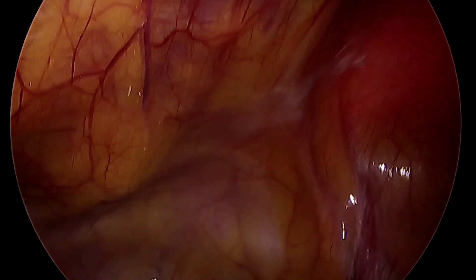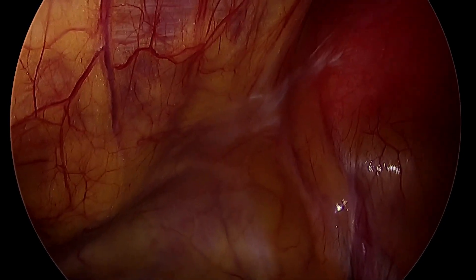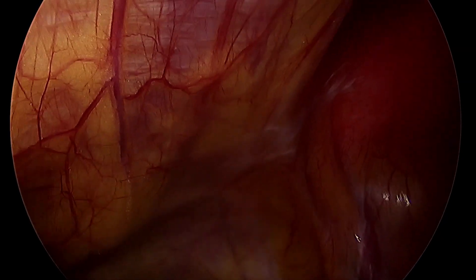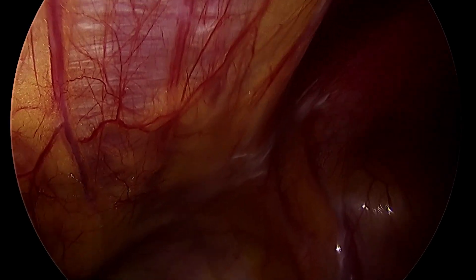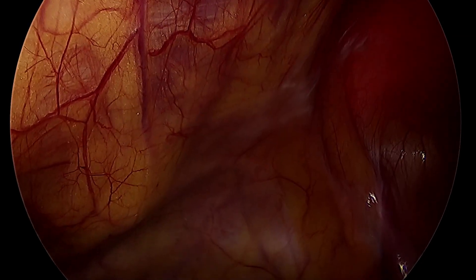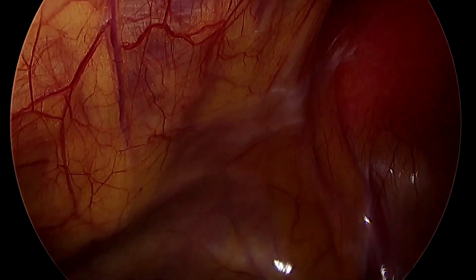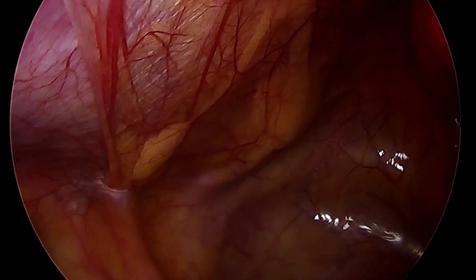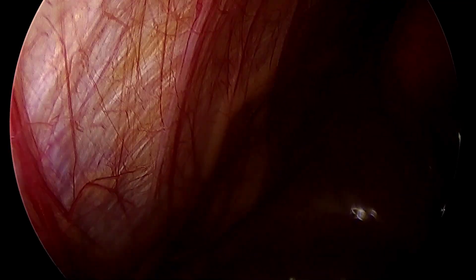Hello everyone, welcome to another video of Laparoscopy Unscripted. Today a patient came to me with a past history of acute appendicitis, and currently the patient had pain over the right upper quadrant. Ultrasound gave a diagnosis of acute cholecystitis. He wanted to undergo both operations simultaneously in the same setting, so we posted the patient for laparoscopic cholecystectomy and appendectomy.